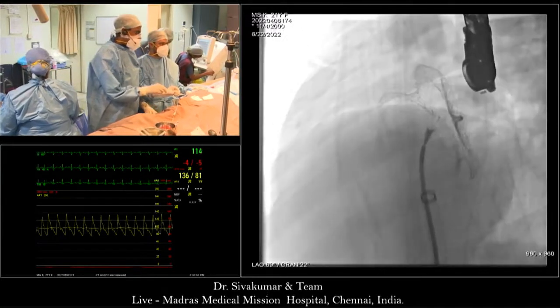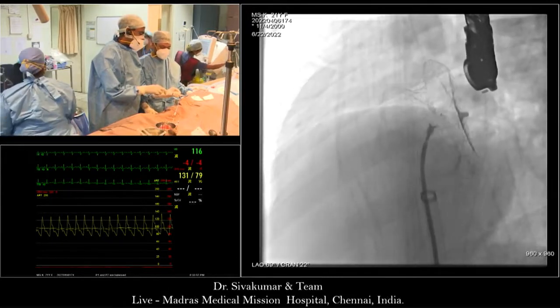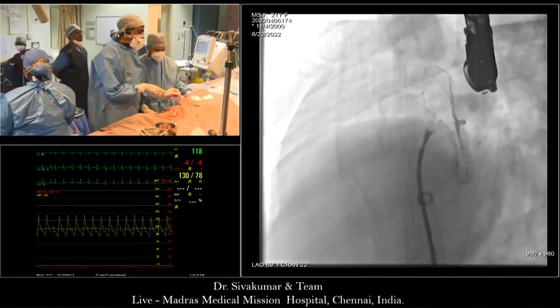What do we think about the waist of this device? Forget the mitral valve for a second. Hands up if the waist is fully formed. Hands up. Waist fully formed. Okay. Waist not fully formed.